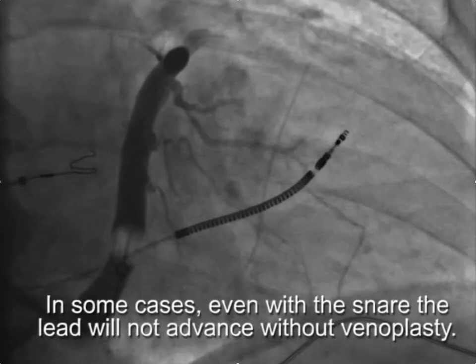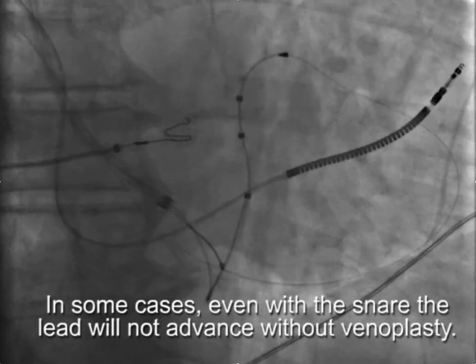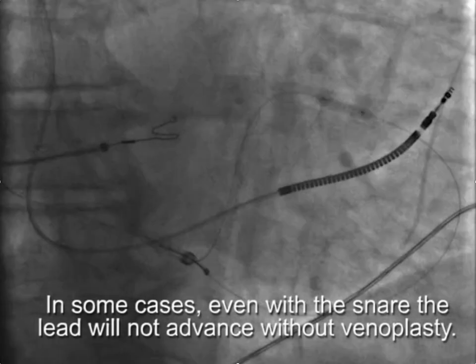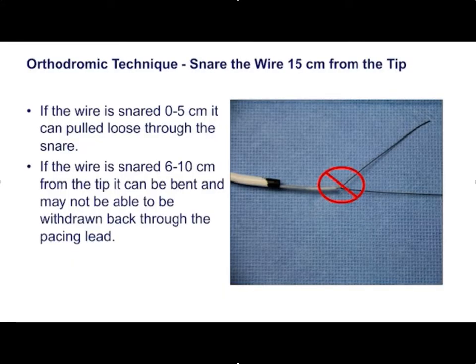In some cases, even with the wire snared, the lead will not advance. In that situation, pull the lead back, put a balloon out and do venoplasty, and then you're able to put the lead in.